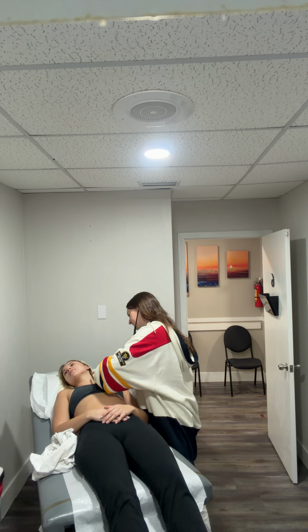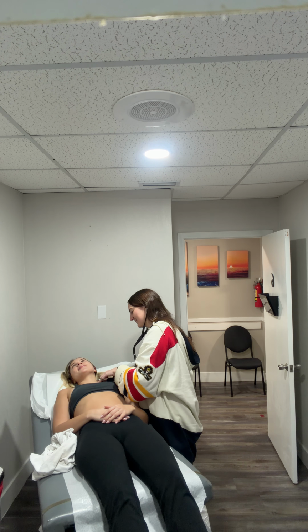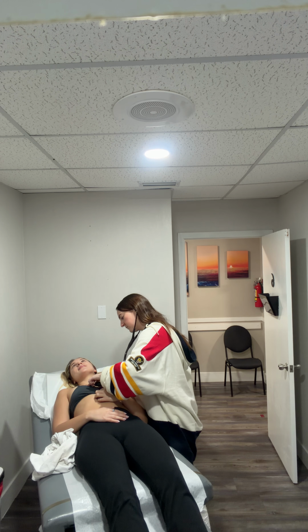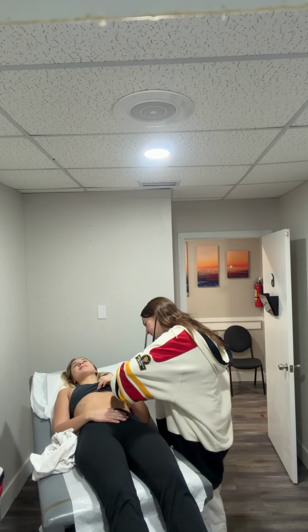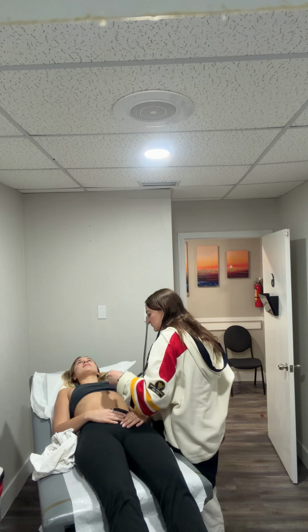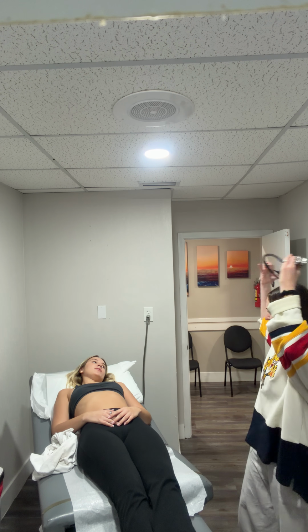Turn your head that way. This way. Perfect. Vesicular sounds.